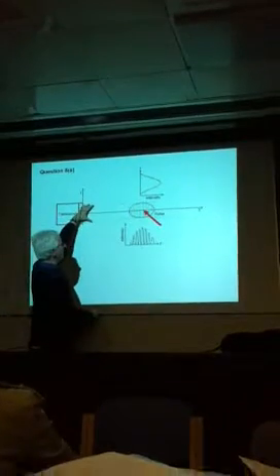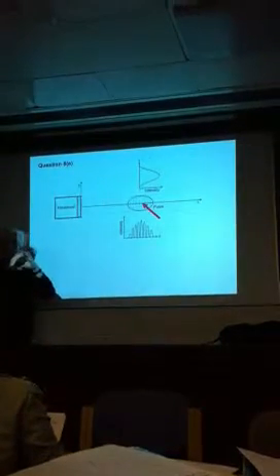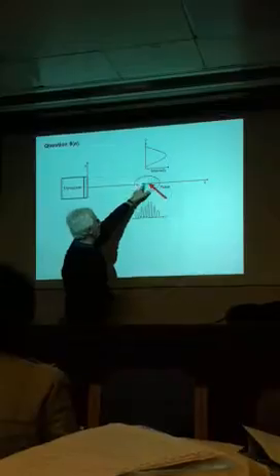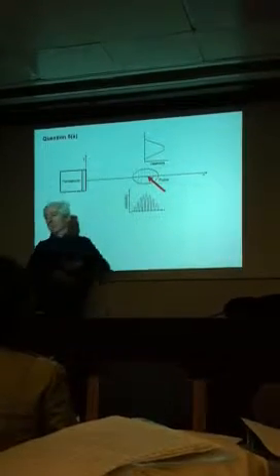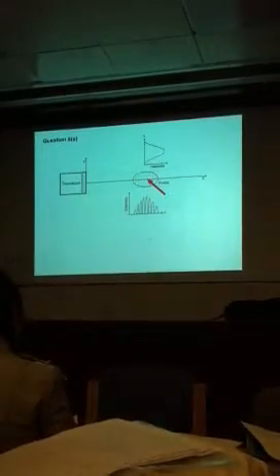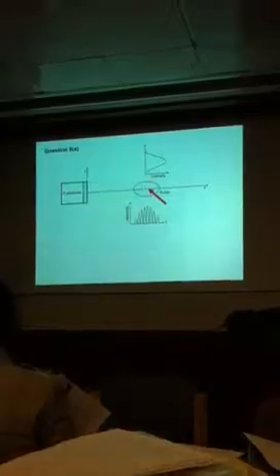And we also consider the fact that the pulse is moving in this direction, and where it is focused is where the pulse is smallest, and that's where we expect the intensity to be greatest. So there is no other position along the axis where the intensity is greater than it is here. So it's going to occur at the focus, probably right in the middle. So we call this point within the tissue the spatial peak. And thus, going back here, the spatial peak temporal average and spatial peak pulse average refer to that specific, unique location within the tissue, which we call the spatial peak.